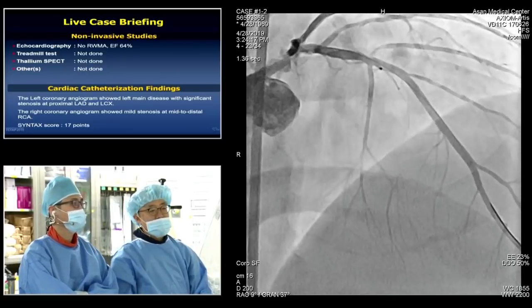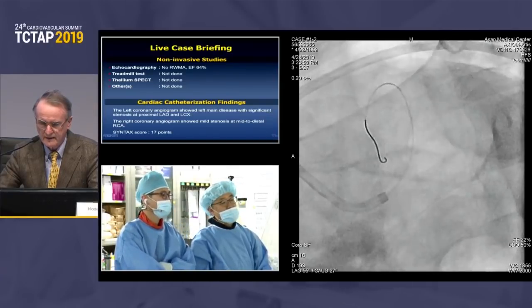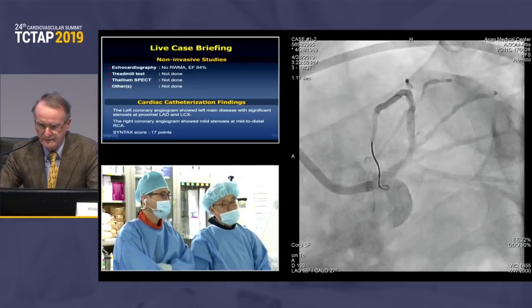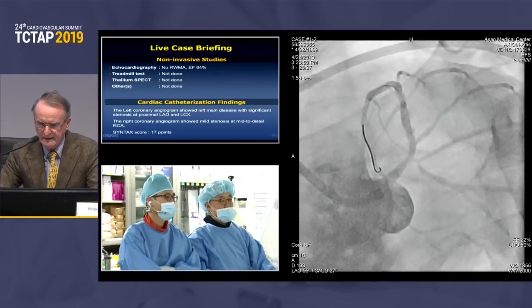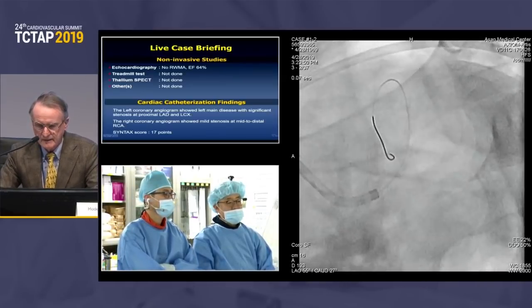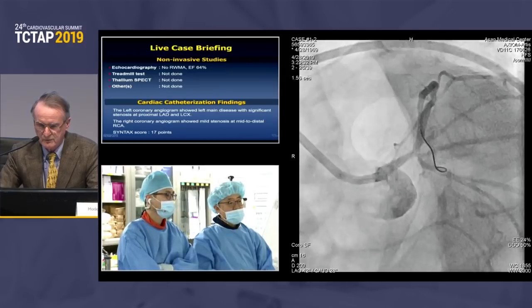Can I see the spider or the caudal view again? Caudal. Okay. So I think here I will really do all my best to go with one stent, because when you have this steep angle and a relatively small circumflex with stenosis, if you place two stents, it's going to be prohibitive. I would be inclined to accept not a perfect result, but to go with one stent.